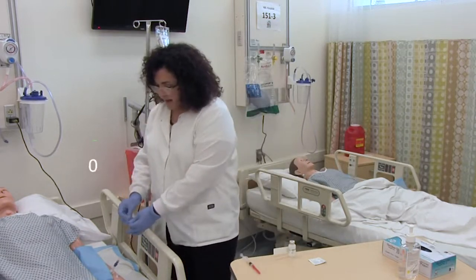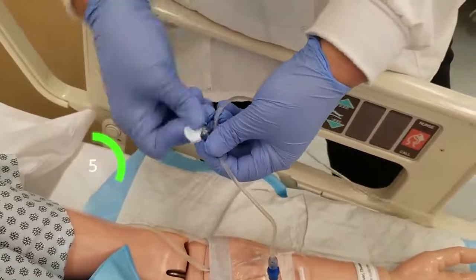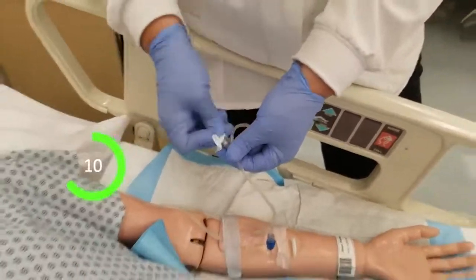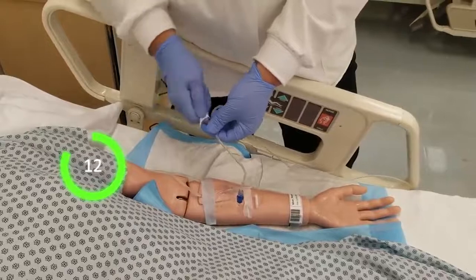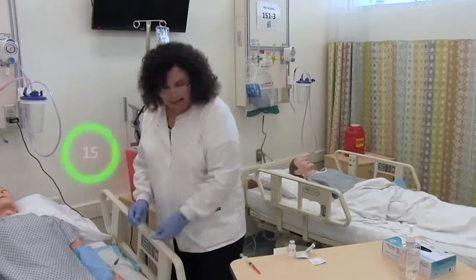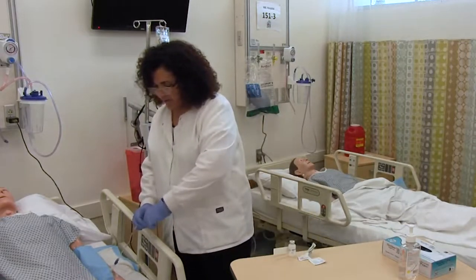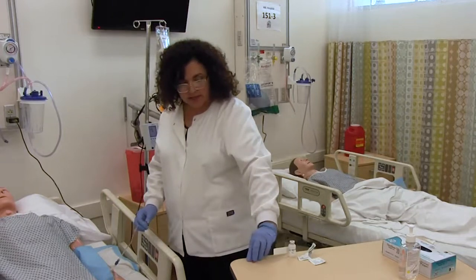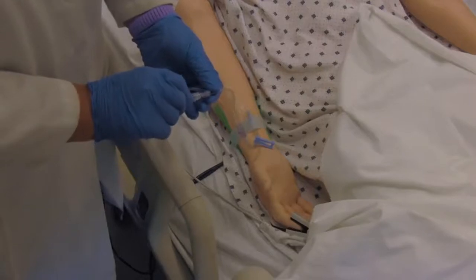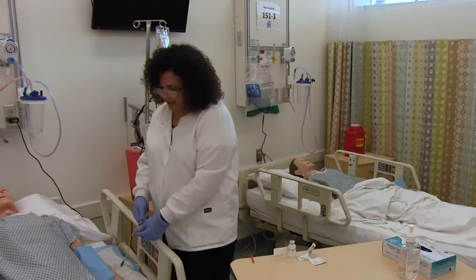So I begin by scrubbing the Y site closest to the patient, and this is where our IV pushes will go. So we do a 15-second scrub. Okay, and then once we do that, we're going to take off that fill needle, and that will go into the sharps container, and we're going to push and twist to attach our medication to the Y site.